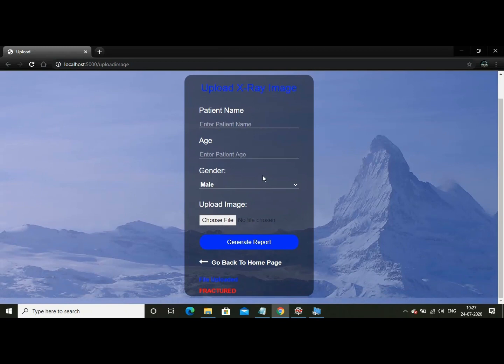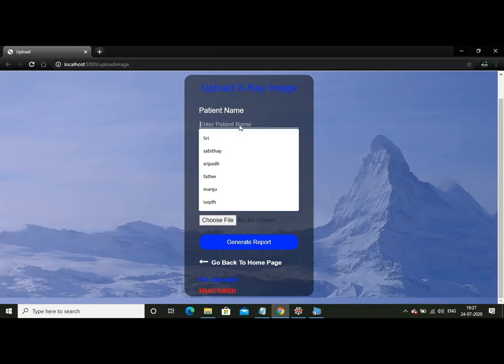Now let us try some different scenario, like some picture which is not fractured.